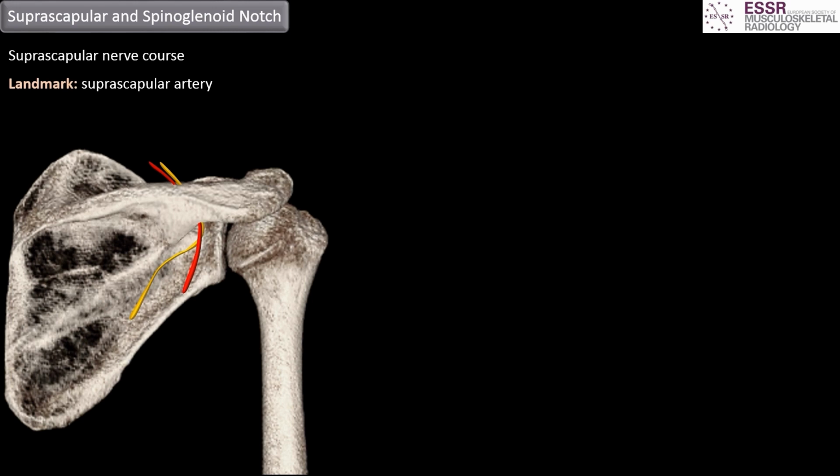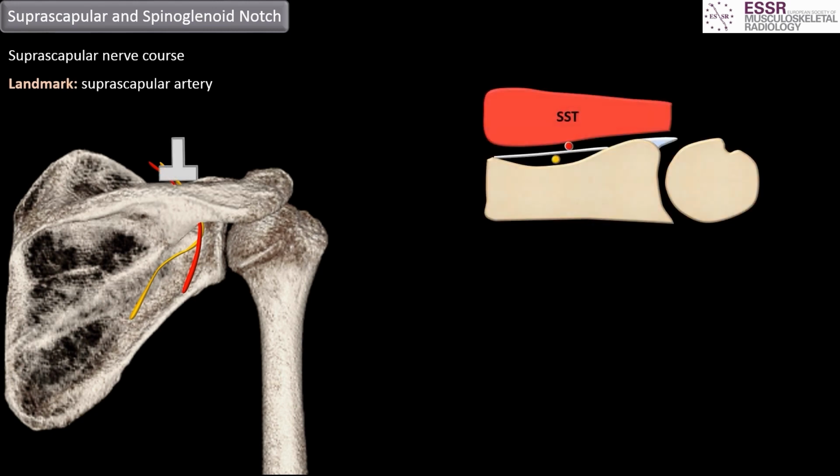As a final step, the suprascapular and spinoglenoid notches should be assessed. These sites represent the bony landmarks and the ultrasonographic identification of the suprascapular nerve along its course. The suprascapular notch is a shallow concavity of the scapula located medial to the superior labrum and glenoid and deep to the supraspinatus muscle, while it is bounded by the suprascapular ligament. The suprascapular nerve is located within the notch, accompanied by the suprascapular artery. Note that typically the nerve travels deep and the artery superficial to the ligament.